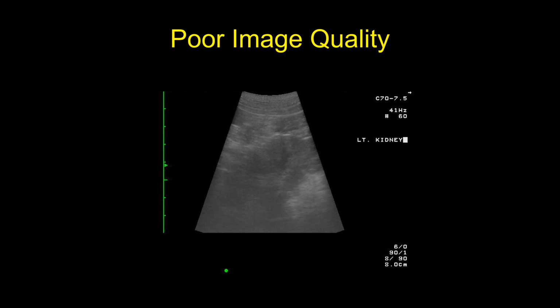Okay, with ultrasound, just like CT and MRI, we're getting a slice of a particular organ, which is nice. But here is a slice. This is part of a kidney right in here, but the image quality is so poor. If I didn't know for sure that was a kidney and had a probe in my hand and it wasn't labeled as such, I'm not sure I could tell you that's a kidney. And I sure couldn't tell you if it's the right or left kidney.